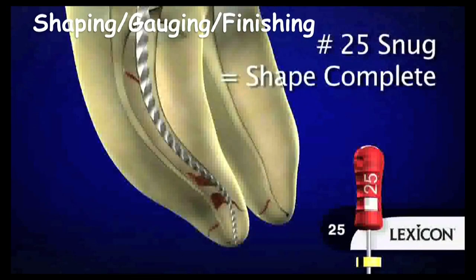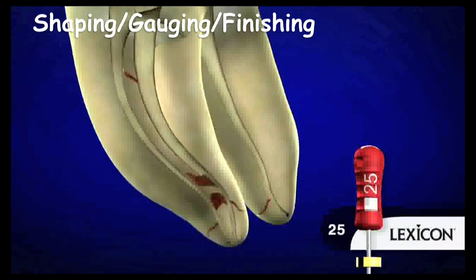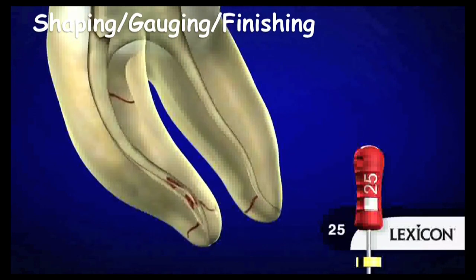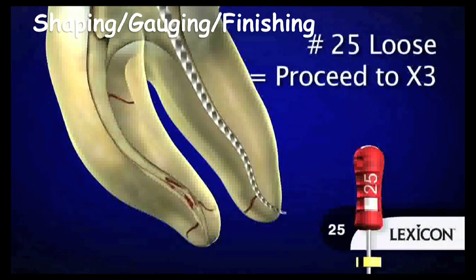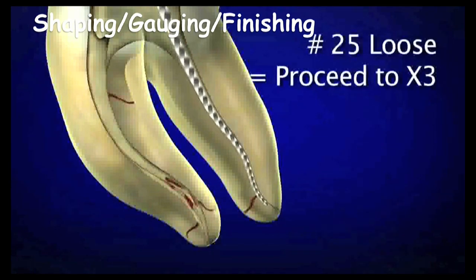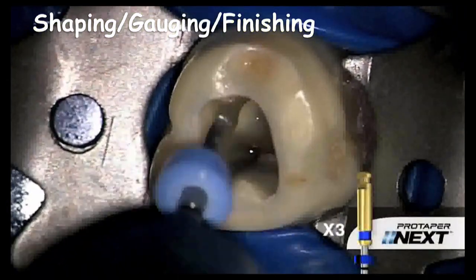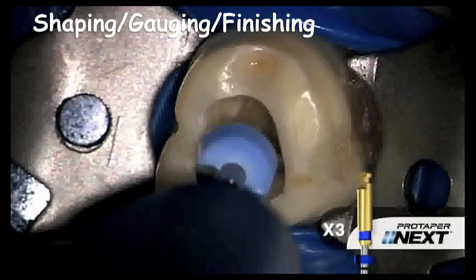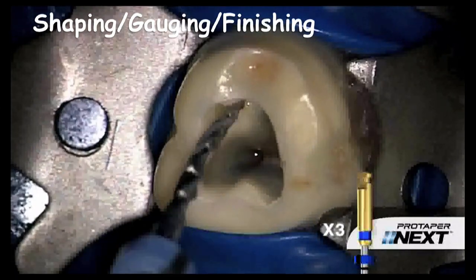When are we done? When is the shape finished? Well, we have to gauge that. For example, X2 dropped to the end zone, and now we flush it and see with a pre-curved 25 file if it falls in snug. That shape is finished. On the distal, however, we notice that a 25 is loose, and so therefore we would proceed with the X3 and make our shape.